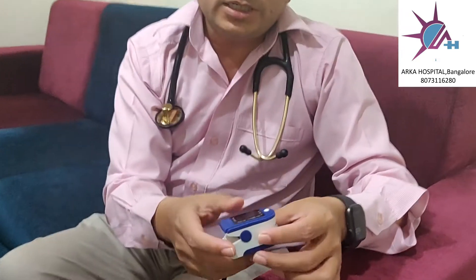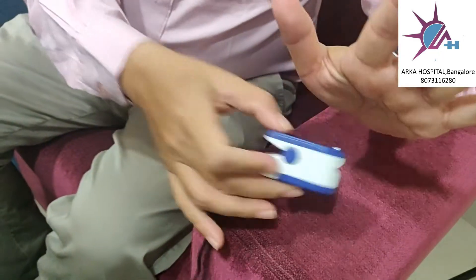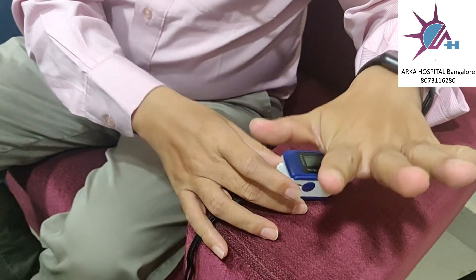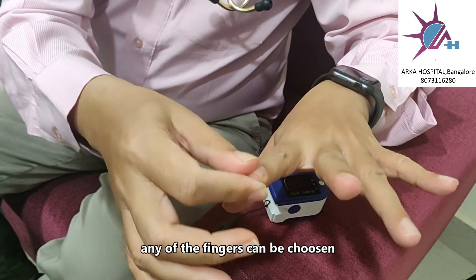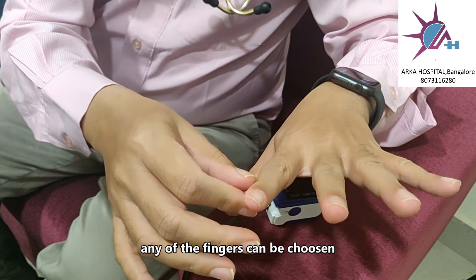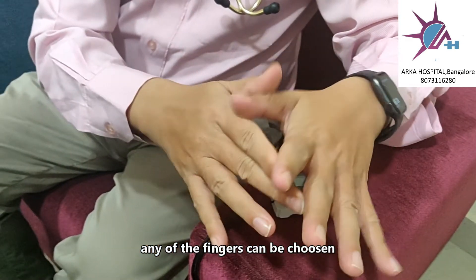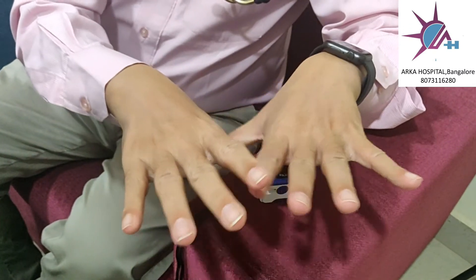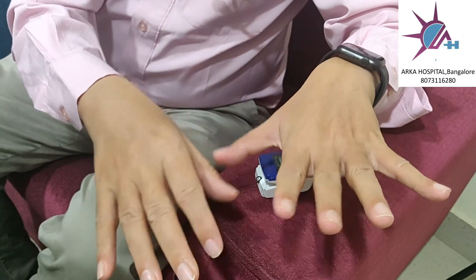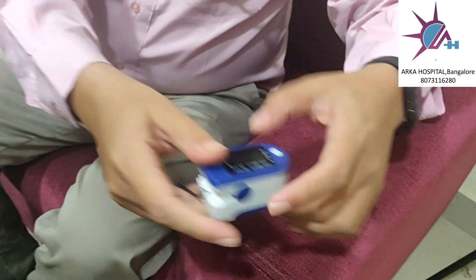This is the pulse oximeter which is usually available in the market for the general public. Many people ask me whether you have to use the ring finger or middle finger, right hand or left hand — so that doesn't matter. Either right hand or left hand the reading will be acceptable, and any finger you can choose.